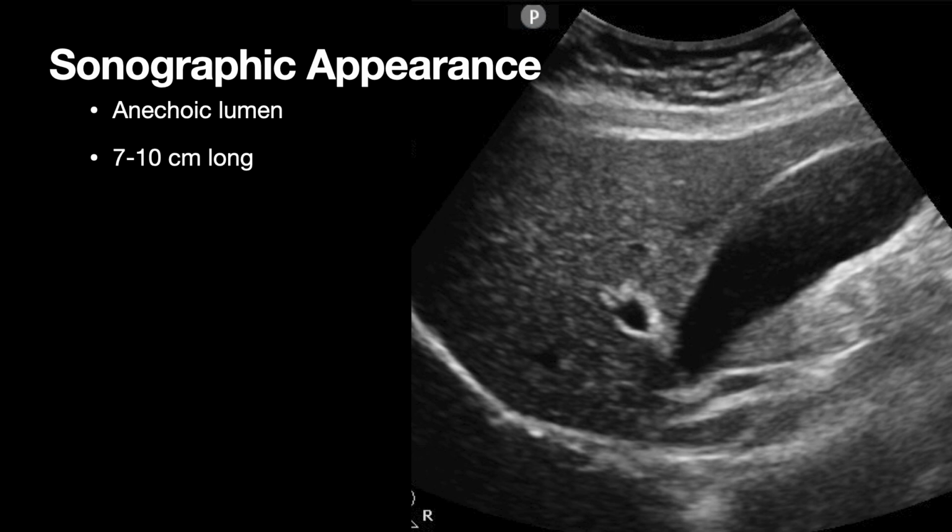Probably, statistically speaking, it's going to be the gallbladder, but I want to scan towards the fundus, which is probably more inferior on the patient's external habitus. I'm going to scan towards that fundus to find that blind-ended pouch. It's a little bit cut off in this image, but you're going to see it stops. I don't want to see it continue. And once I find a blind-ended anechoic pouch, then I know I'm in the right place.